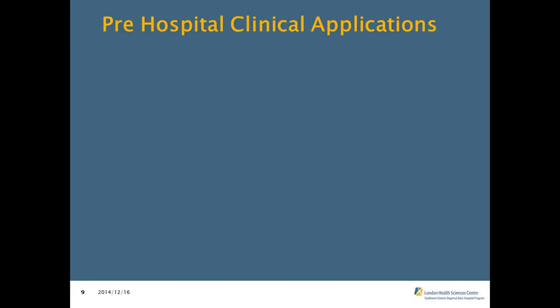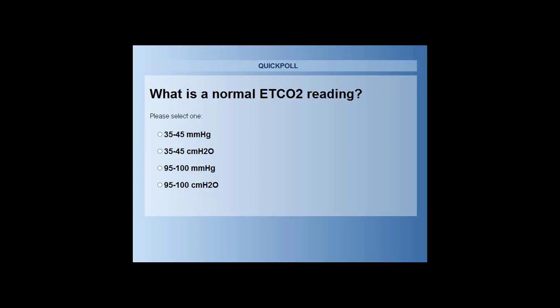All right, so we're sitting at 70% answered option A, EndTidal carbon dioxide. That answer is correct. So remember, ventilation is how effectively carbon dioxide is being eliminated from the body, and that's where your capnography comes in. It's measuring the elimination of carbon dioxide over time.